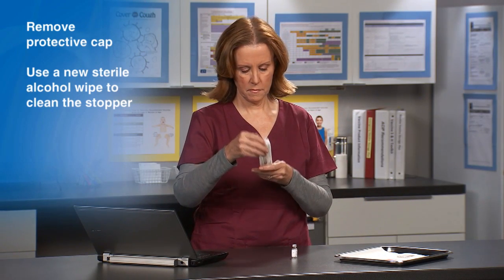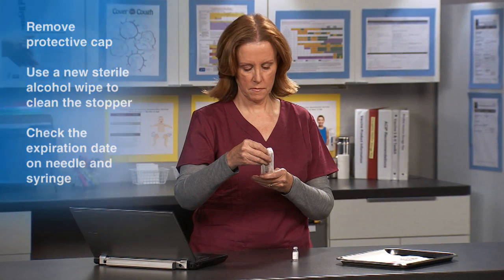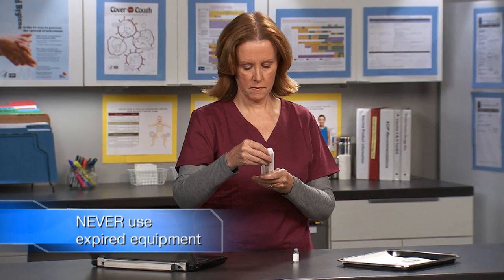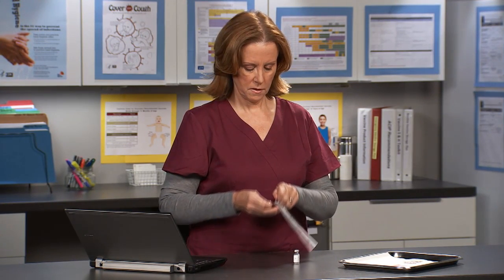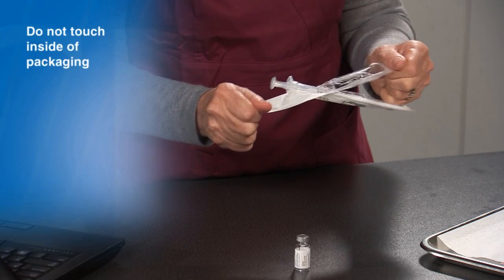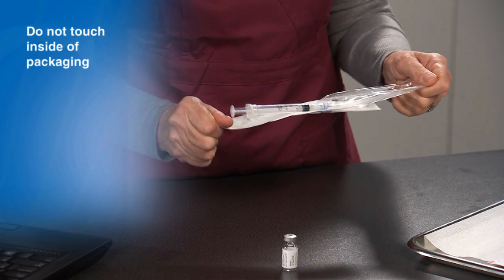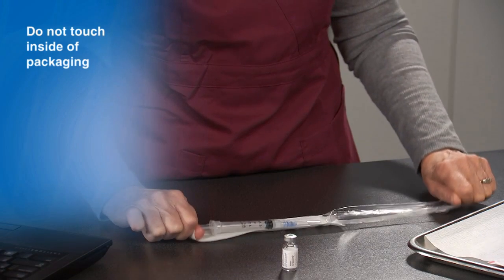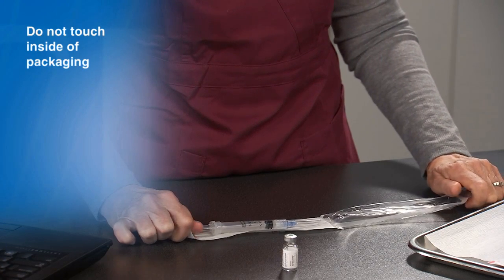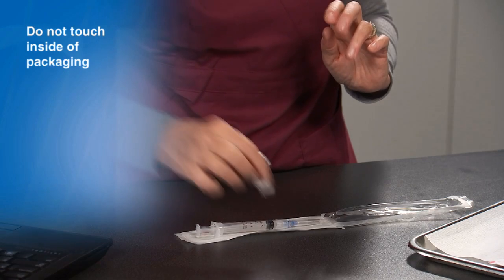While the alcohol is drying, check the expiration date on the needle and syringe if present. Never use expired equipment. Next, carefully open the needle and syringe. Be careful not to touch the inside of the packaging or where the needle attaches to the syringe. Place the packaging inside up on the counter with the needle and syringe resting on the inside of the packaging.